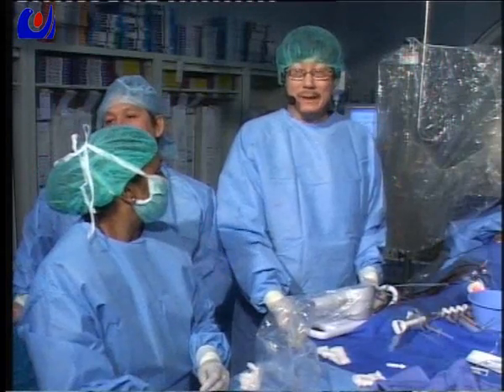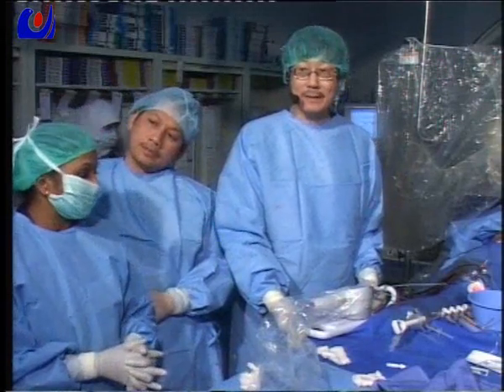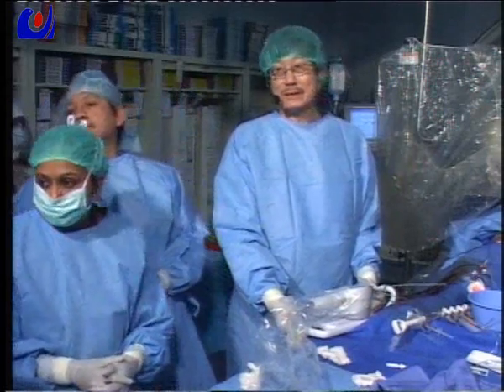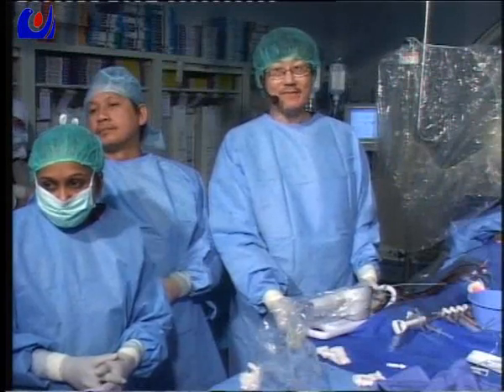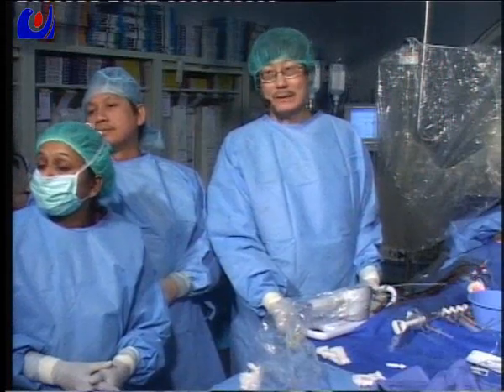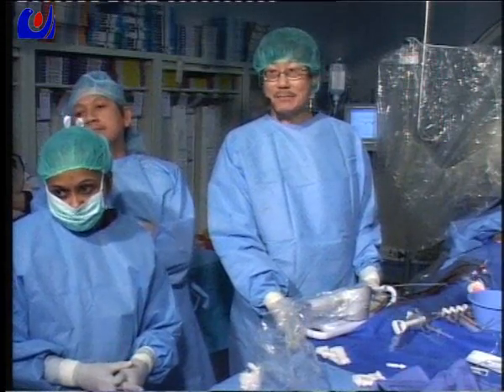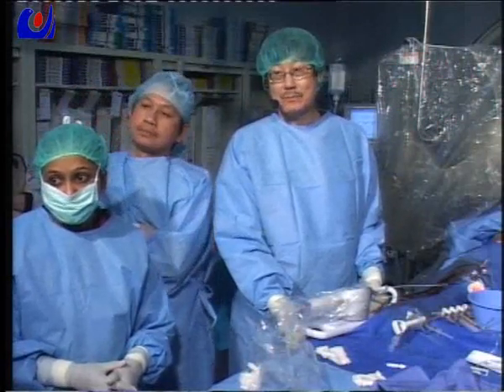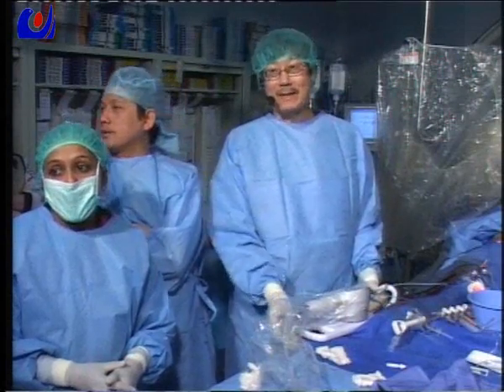Deployment at about 10, 12. Then we pull back, get up to 16. Then overlapping, according to the stent balloons, measuring 3.0 by 38, overlapping with the 2.5. The proximal edge was just before the left main ostium. Then after that, we do the third stent, 3.5 by 23, because it showed 24 for the Promus Element. So we pick up a Xience V, 3.5 by 23 for the left main.